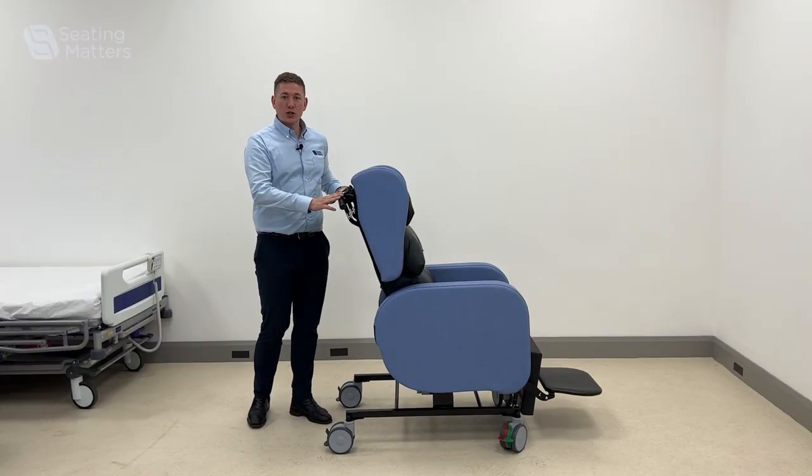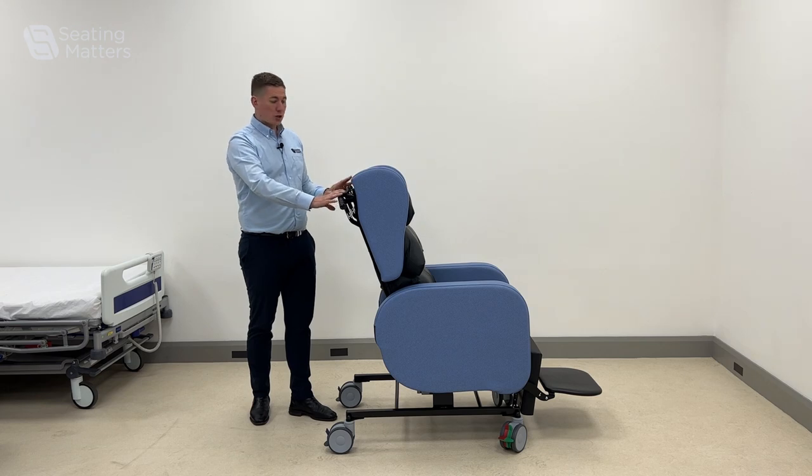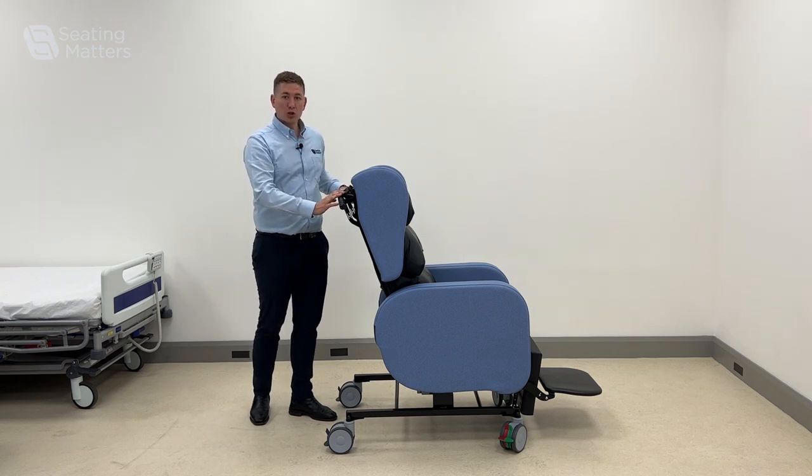This is the Seating Matters Sorrento chair. At the back on the handle, we have two levers for the main movements and functions of the chair.